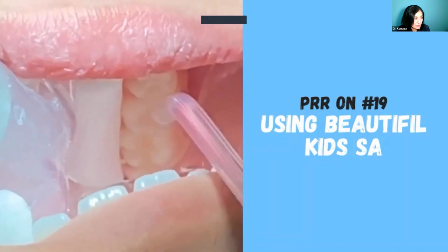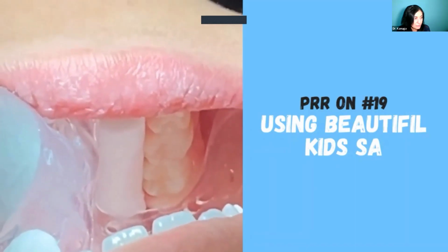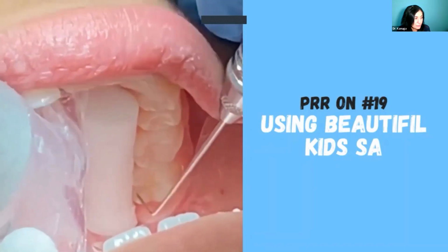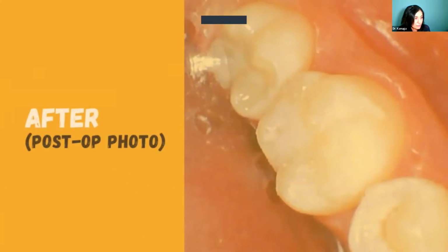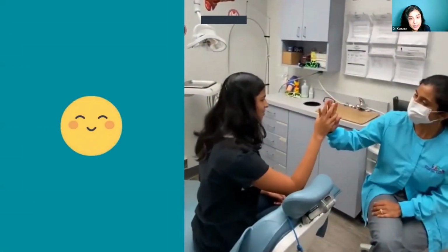Doing really good, sweetheart. Open a little more, sweetheart. Okay, that's perfect. That is done. Okay, so in this video you saw sometimes you can need a cotton roll with the Isolite, to just kind of keep that wing out of the way. So you have to kind of improvise.